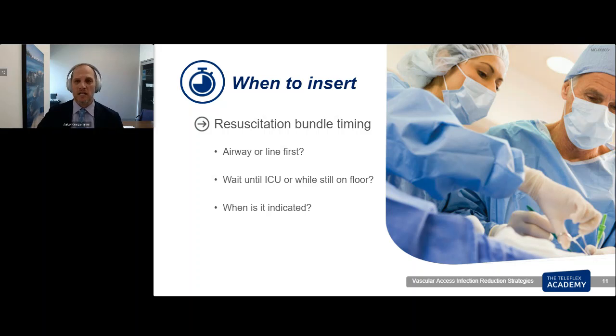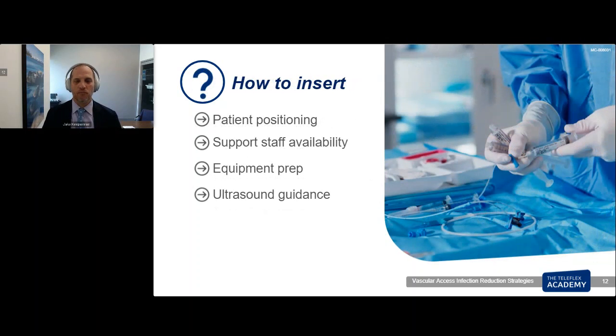And when is it indicated? So just because somebody might in the future need pressors doesn't mean a central line is indicated. Just because they might need a lot of blood draws doesn't mean central lines are necessary. So let's go through several steps. One, how to insert. Patient positioning. It's important that you take the extra time to position the patient appropriately.